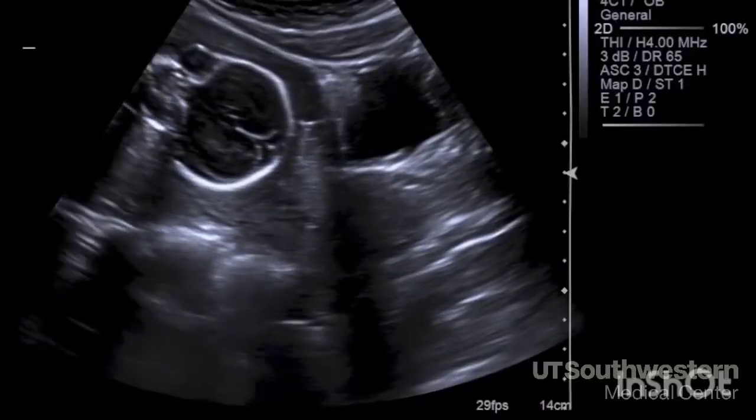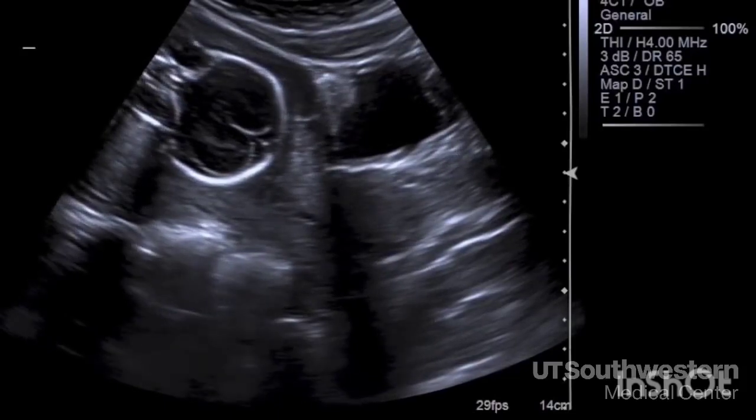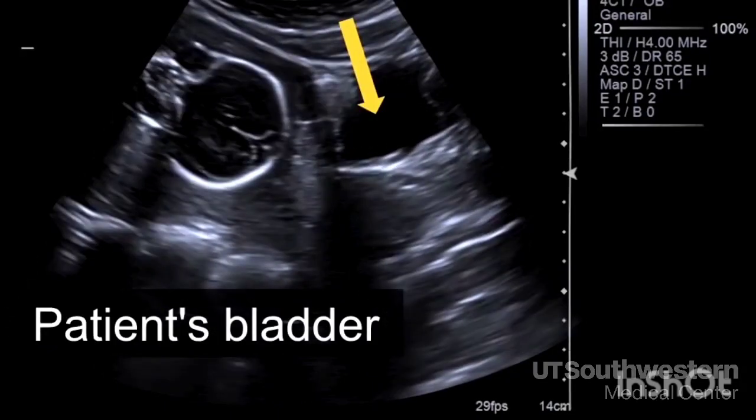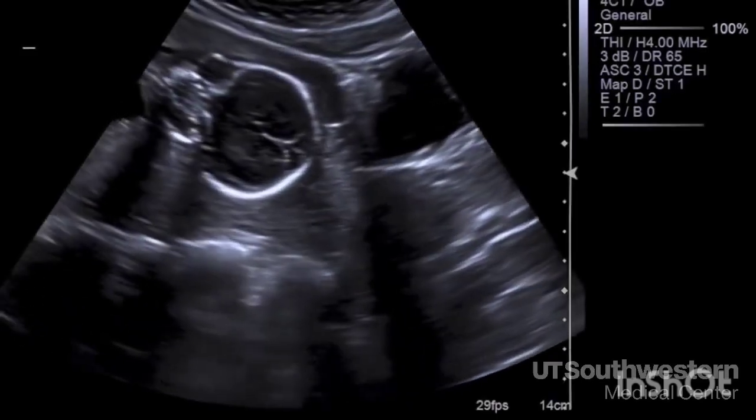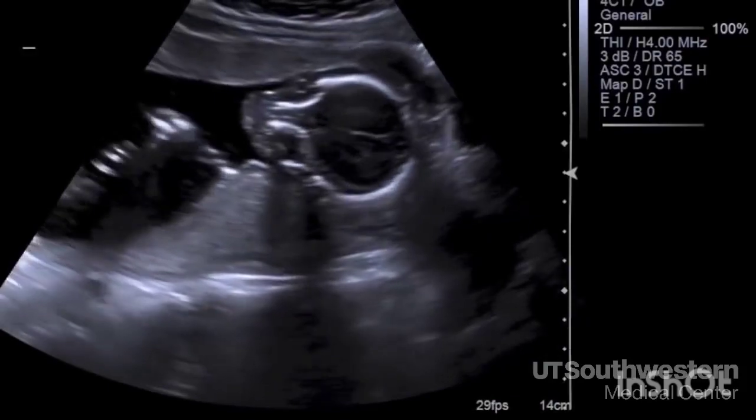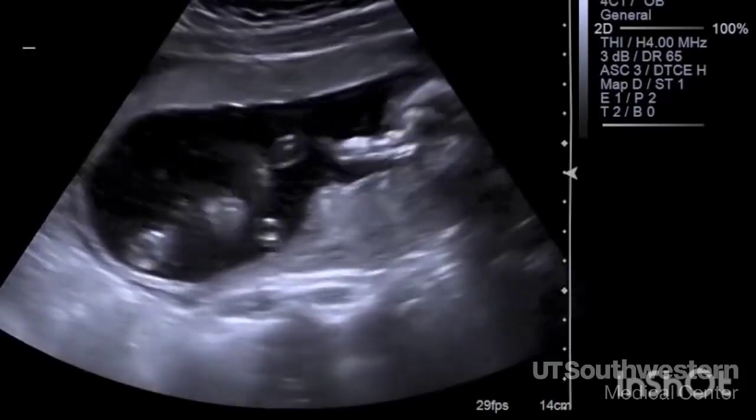On an ultrasound, fluid is black, bone will be white, and other tissues are shades of gray. This is the patient's bladder, and the fetal head is down near the cervix. The position of the fetus doesn't matter at all at this point in time. We often see the fetus completely flip around during the course of the ultrasound.